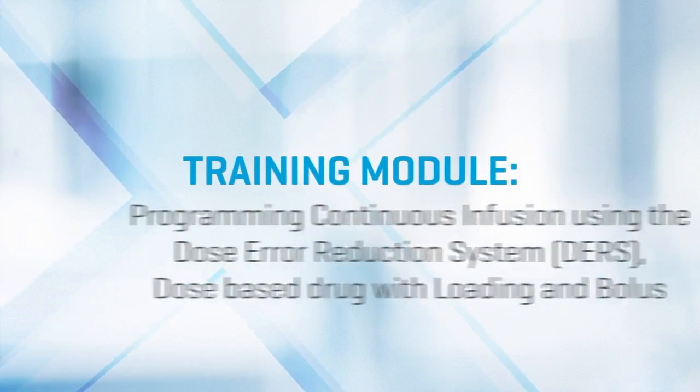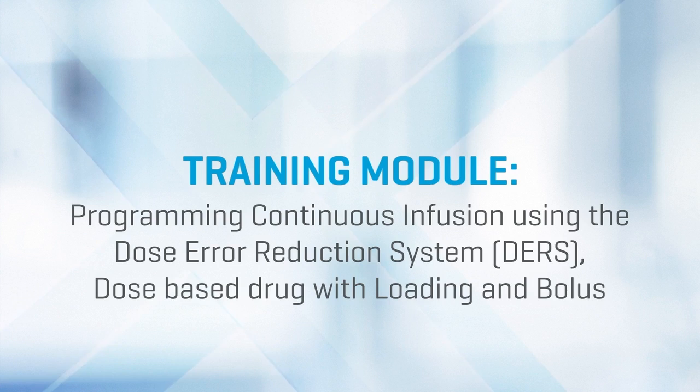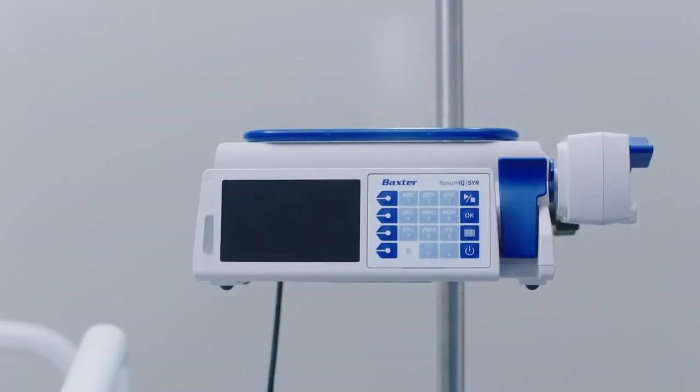Training Module. Programming continuous infusion using the Dose Error Reduction System, DERS, dose-based drug with loading and bolus. Before use, please refer to the Novum IQ Syringe Infusion System Operator's Manual to review all cautions and warnings. Press On/Off to power on the pump.